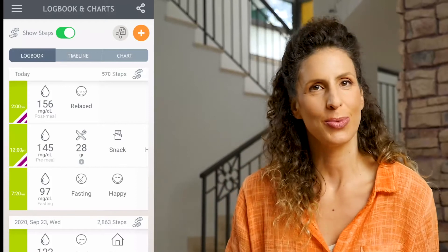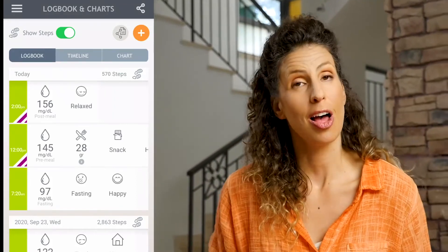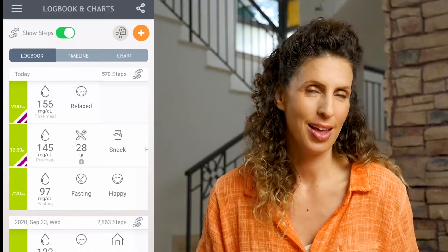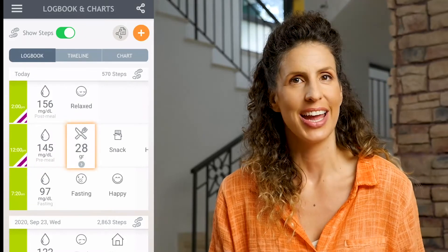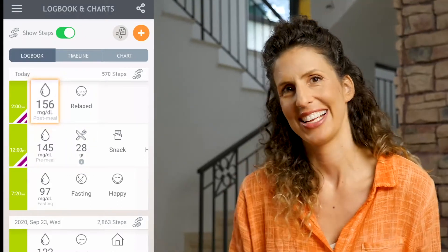Welcome back! I took my post-meal reading and you can see from the logbook that I tagged it as post-meal. Now I have a clear picture of my blood sugar before I ate, how many carbs I ate, and my blood sugar now after I eat. I'm happy with my post-meal number, but when you see a number higher than your post-meal target blood sugar range, take a moment to examine what you ate and the total carb value. Over time you will learn which foods spike your blood sugar level and which foods help you stay in your healthy range. Testing around meals gives you valuable insight into your diabetes management and is a great way to reach your health goals.